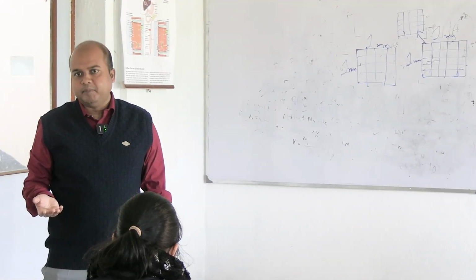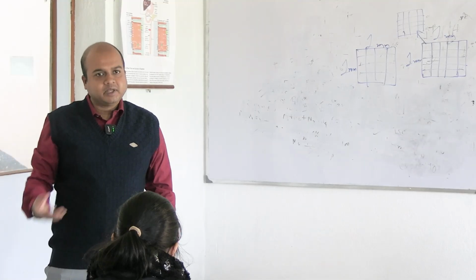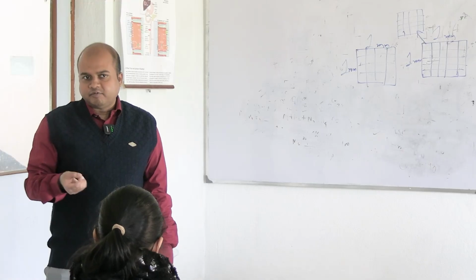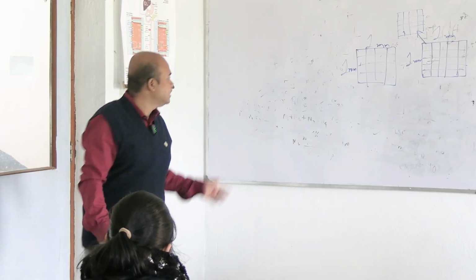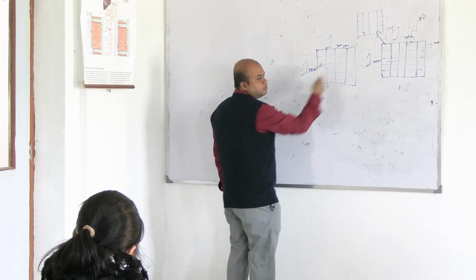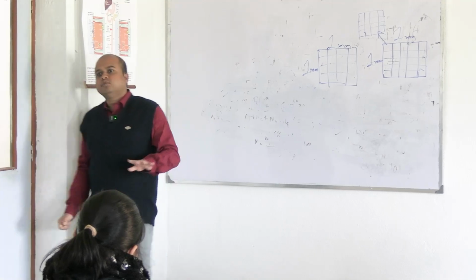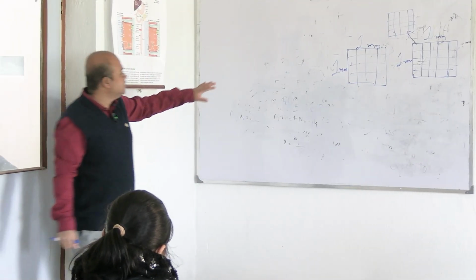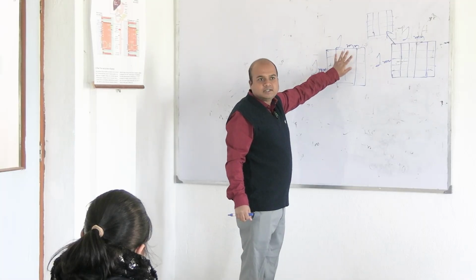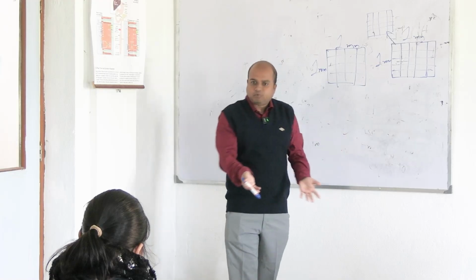That we are assuming. But practically, when we are doing hands-on, especially as beginners or those doing it after a long time, what happens? If charging is appropriate, then say blood comes into these 4, 5 squares, but the charging will not be uniform. But if that is done correctly, assuming this, what will happen? If the charging is uniform, then as the dilution is less, more cells will be there. If blood is not diluted, a lot of cells will be there because that will become the count.